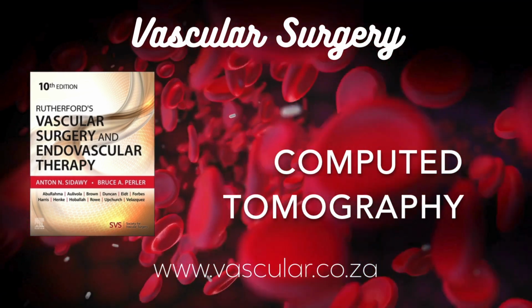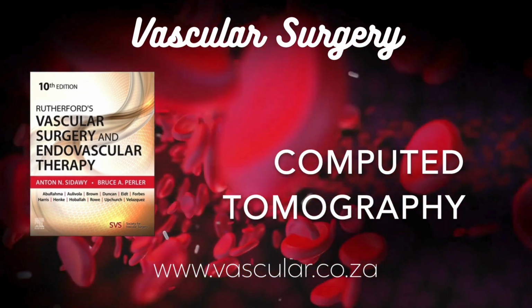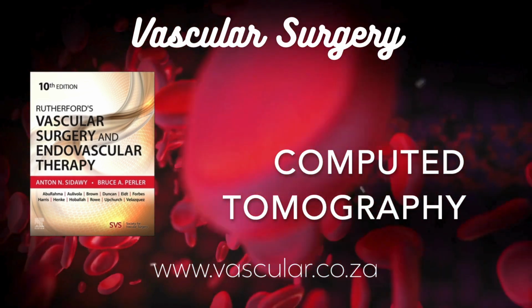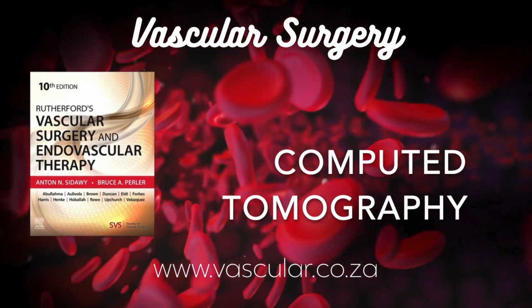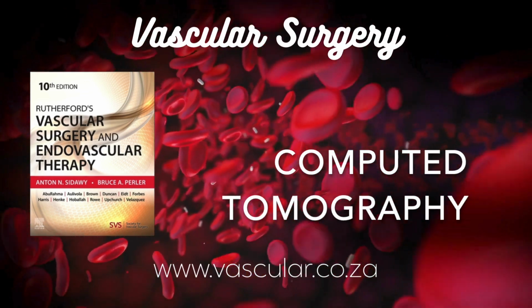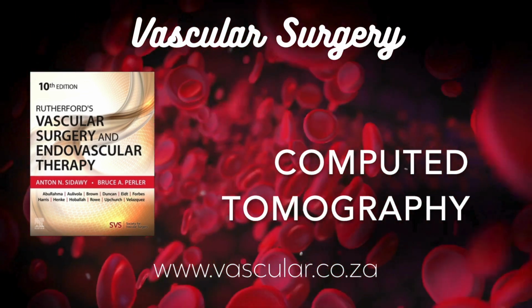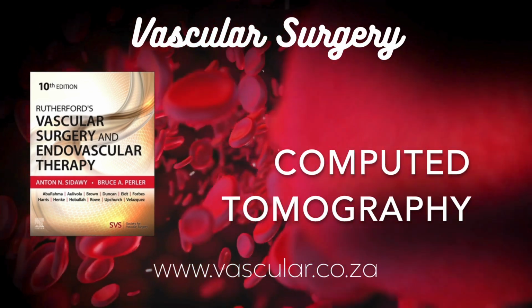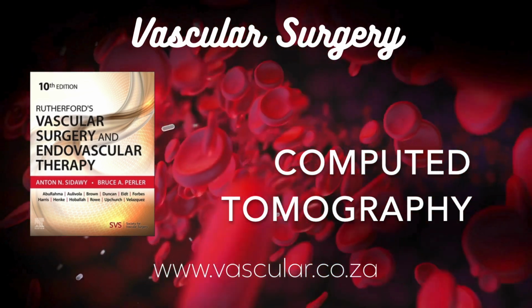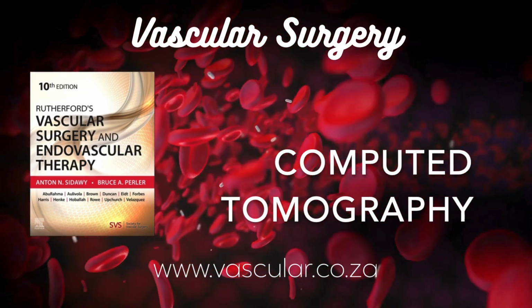How does a CT scanner actually see inside us? What's the core mechanism? At its heart, it's pretty simple. You've got an emitter shooting out a very thin focused beam of X-rays, and directly opposite, a detector that measures how much of that X-ray beam gets through. So it measures how much the beam is weakened. Exactly. That weakening is called attenuation. Different tissues, bone, muscle, fat, air, they all attenuate, or block, the X-ray beam to different degrees. Makes sense. Bone blocks more than air.